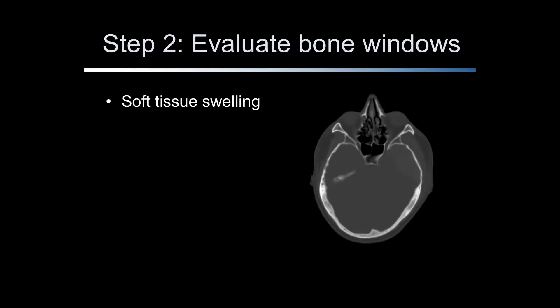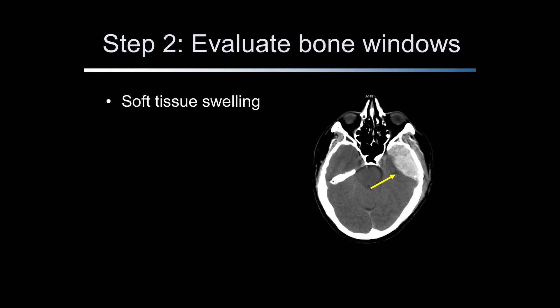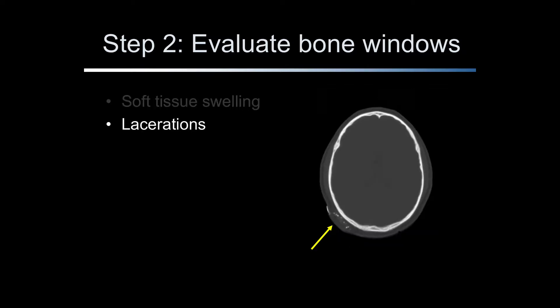Step 2 is to evaluate the bone windows. This is especially important for trauma patients. First, look for soft tissue swelling. Soft tissue swelling seen on bone windows should prompt the reader to look for underlying skull fracture or parenchyma injury such as cerebral contusion, subdural, or epidural blood on corresponding cuts of the parenchyma windows. The reader should also look at the contra-coup parenchyma for contusion. Lacerations, like soft tissue swelling, should prompt the reader to look for bone injury and brain injury in corresponding slices on the parenchyma windows.